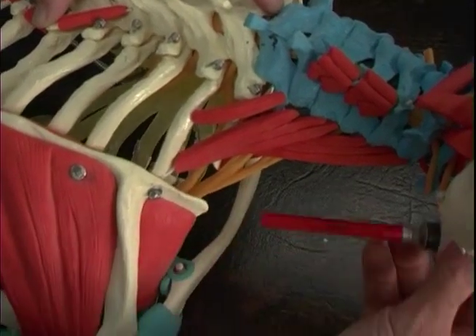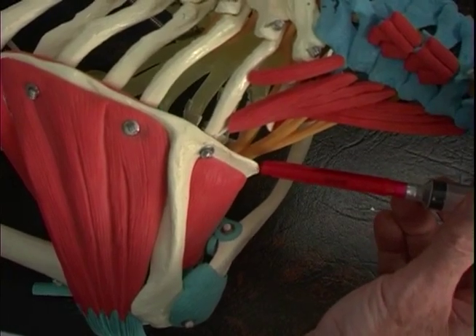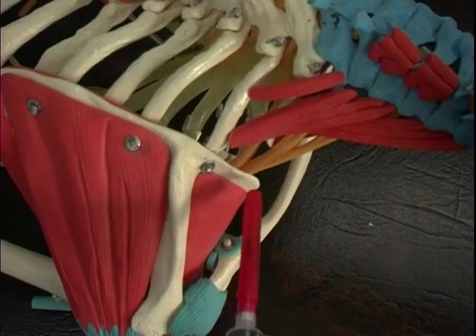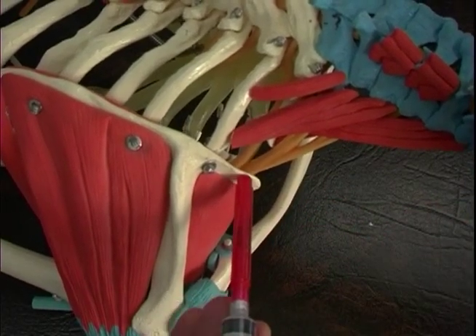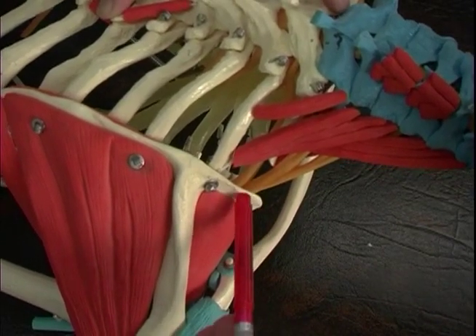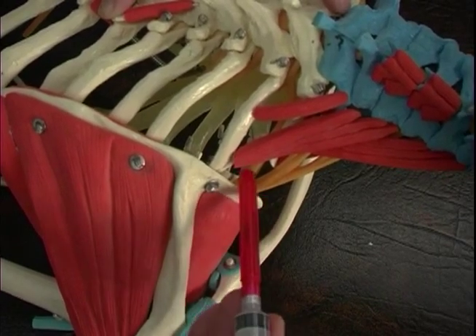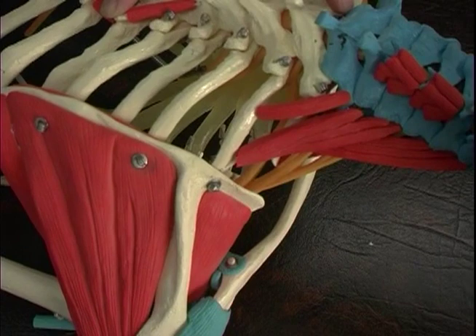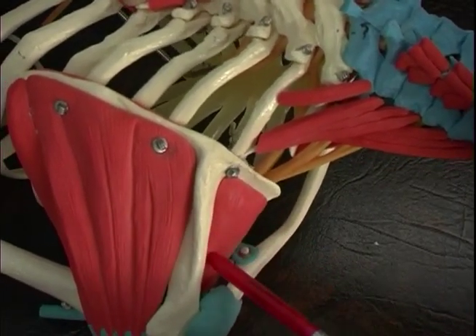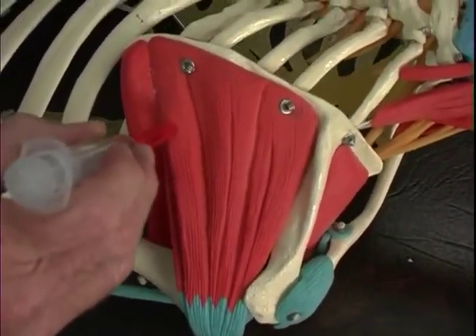And then, rather than coming down in this direction onto the scapula there, because it's very hard to hit, you're going to slide off one side or the other, we come in this direction, perpendicular to the bone, and then we walk to the edge of the bone, drop off, and then come back slightly and inject that levator scapulae right along that area of the edge of the scapula there. Injections can be carried out deep into the supraspinatus, right down here, right along the spine, and of course all over the scapula here.